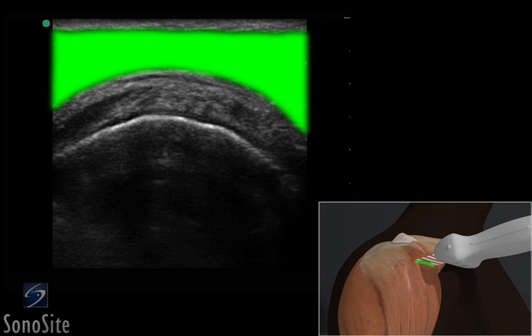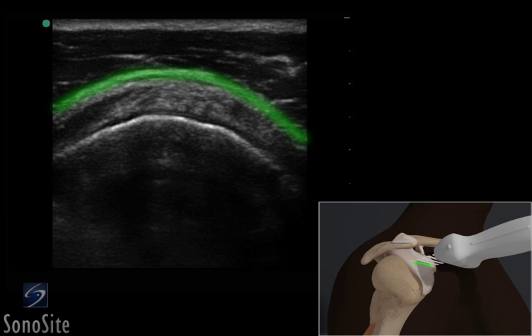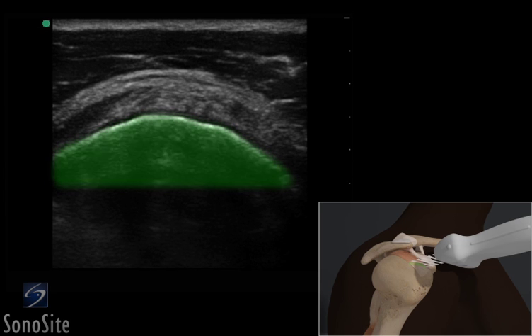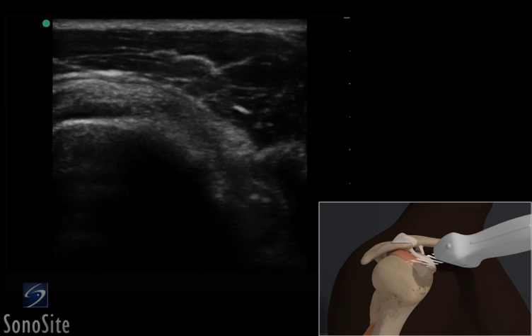The deltoid muscle is the most superficial structure and overlies the supraspinatus tendon. The subacromial subdeltoid bursa is seen as a thin, dark, hypoechoic line between the deltoid muscle and the supraspinatus tendon. The bright hyperechoic humeral head is seen deep to the tendon. The transducer is slowly moved from side to side to evaluate the integrity of the fibers.